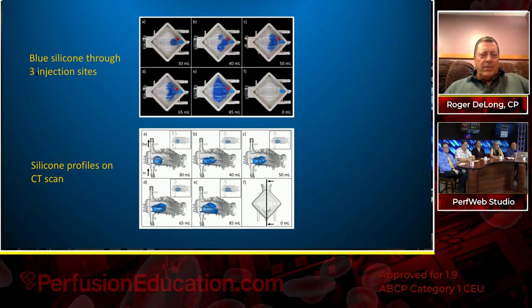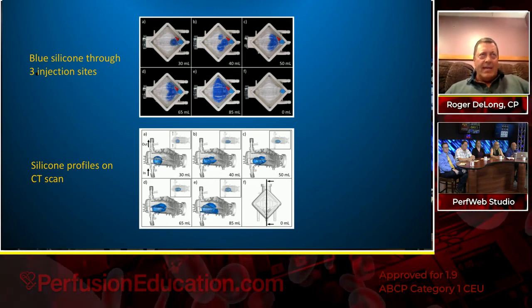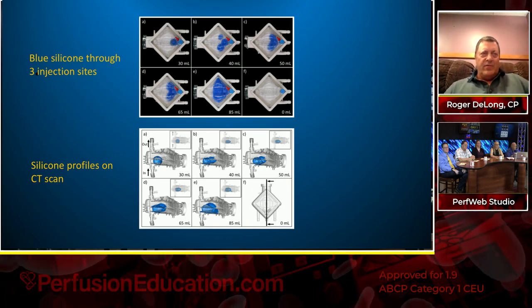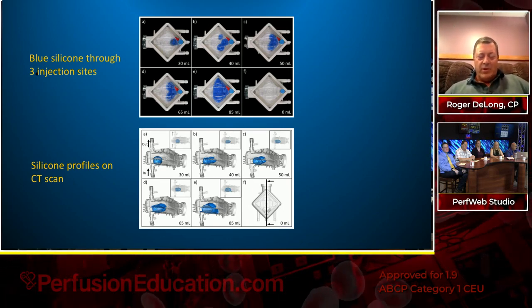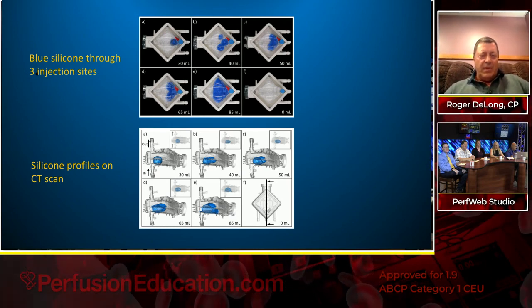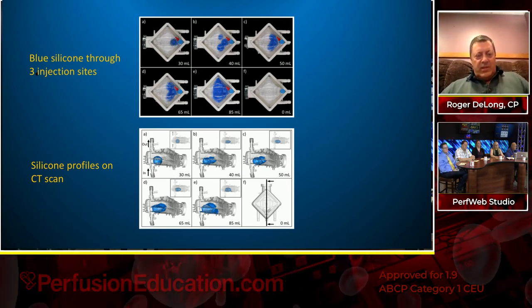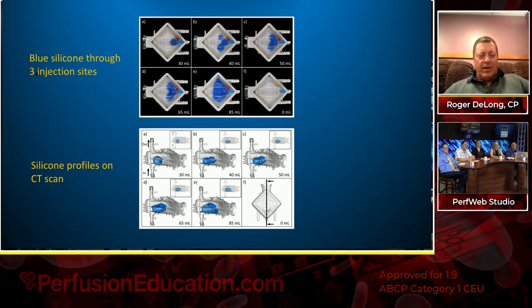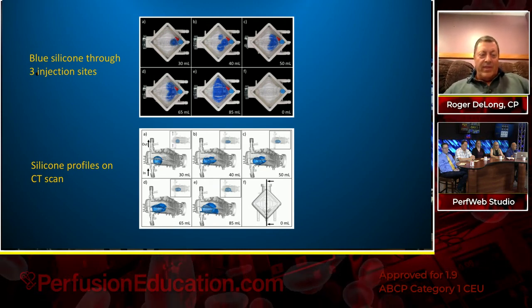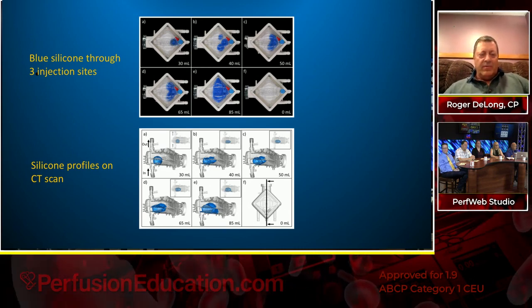Now, silicone's more cohesive and adhesive than a blood clot. Blood clot would have more of a diffuse form, with more tentacles, fiber shapes, etc. However, the point would be this: in a single lump form, you can see pretty readily that some of these percentages can show a lot of clot within the fibers and not even be visible.